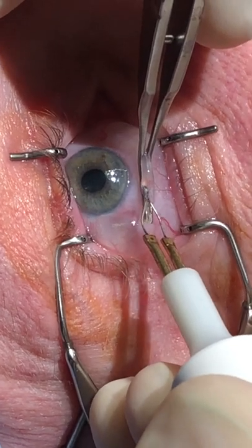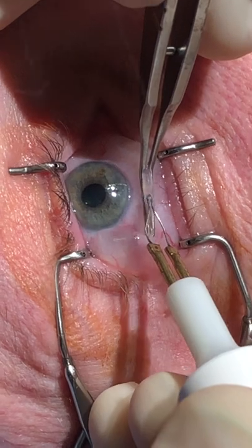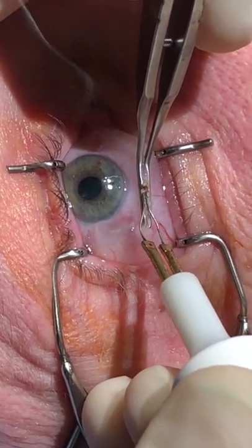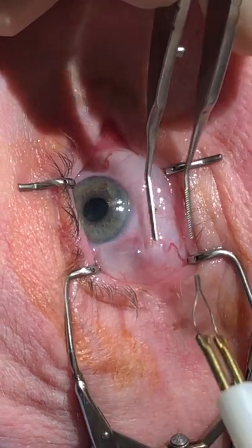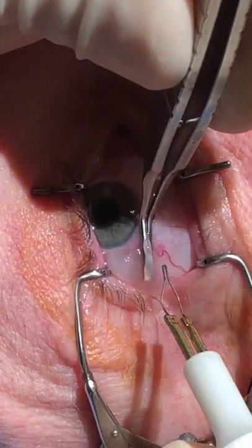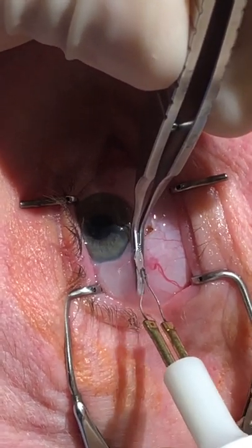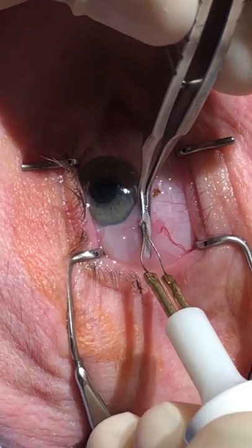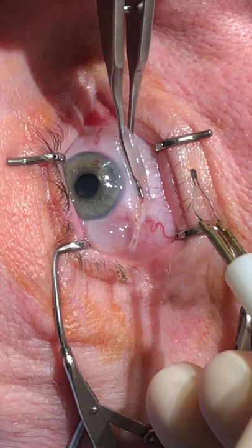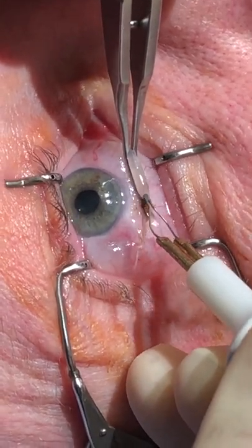What we're trying to do is tighten that excess conjunctiva so that when he's blinking, the conjunctiva is not flopping over the lid margin and blocking the meibomian glands. We're just providing a little tightening here to that conjunctiva that I've blown up.